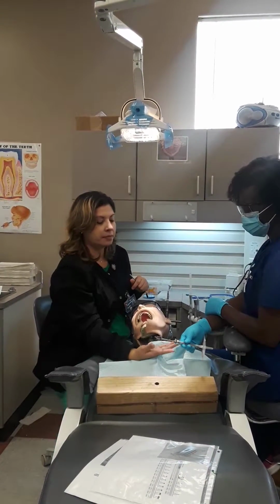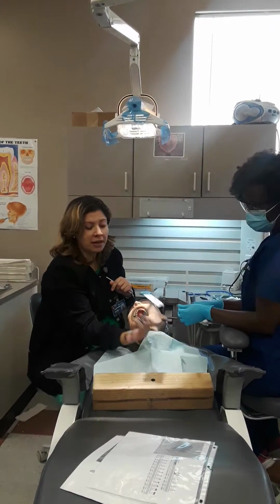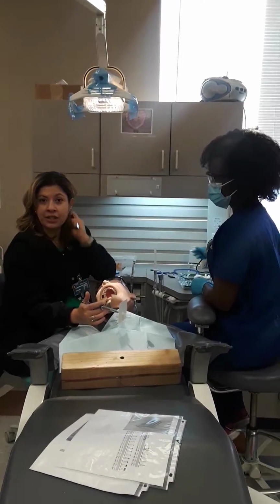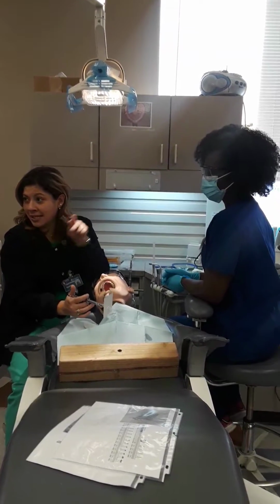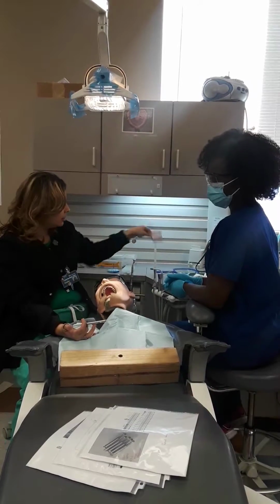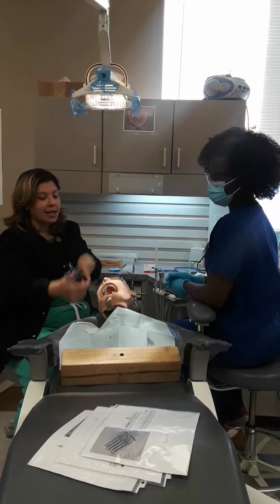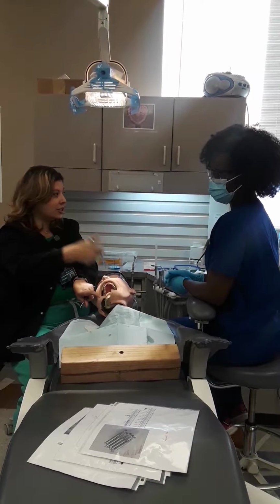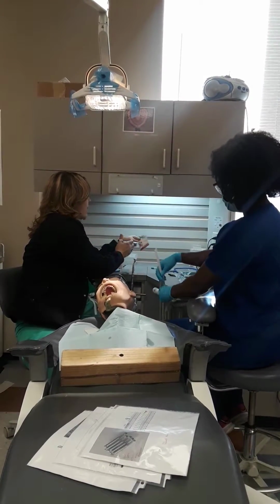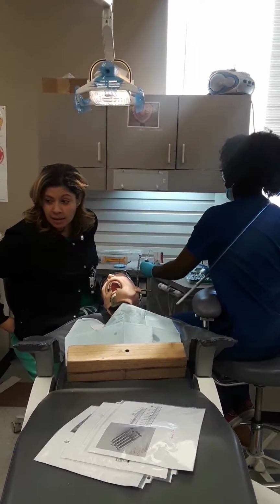Okay. She passes my syringe, making sure that my thumb is in the hole, my fingers got the grip. Depending on your doc, we're not doing it here though. We're just going to make sure that nobody gets extra poked. We're just going to stay safe. Your doctor may require you to take off the cap and expose the needle. You're going to drop the needle here if he has you do that, because he needs to get back to it. And then he'll go in and do his injection, and then he will recap. He will never repass this back to you to recap it, because that's just another way for you to get poked, and it's against the law.